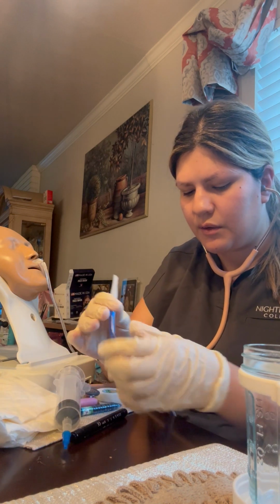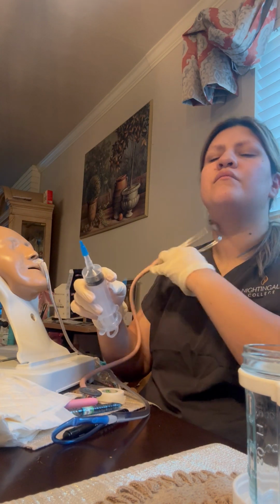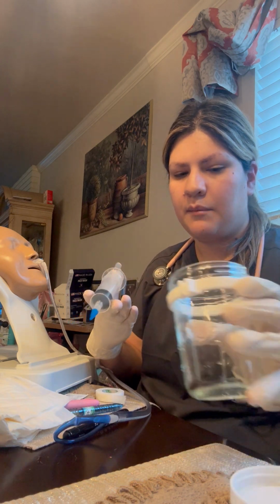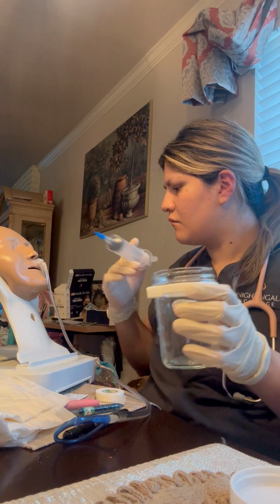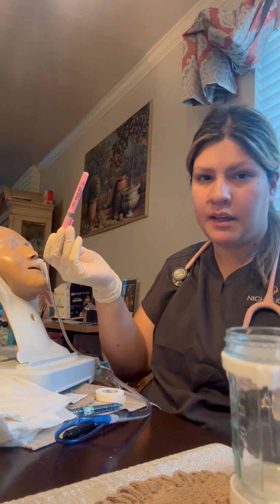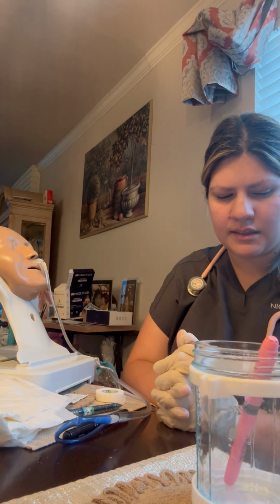And I'm going to clamp that. Okay, so I'm going to whoosh this around. And I'm going to put it in my specimen jar. I'm going to take my pH stick, put it in there so that I can test the stomach contents.